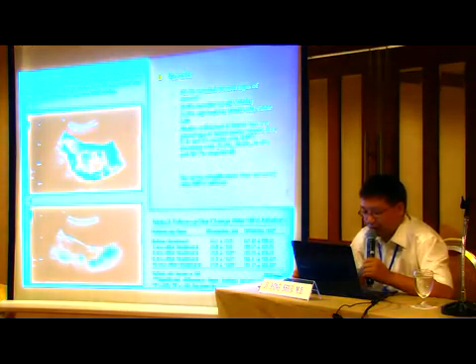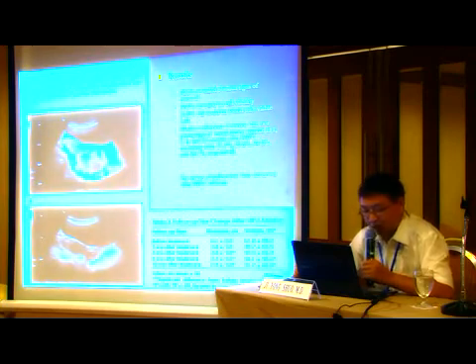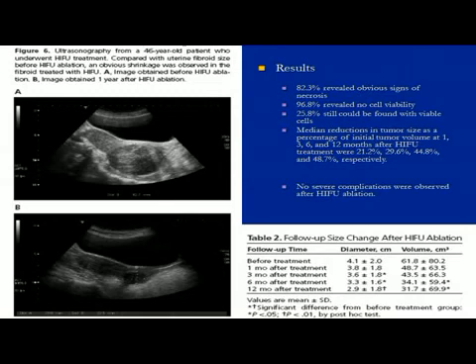However, the tumor generally doesn't disappear, but it may not be probed by the B-mode ultrasound, which is related to the resolution of the B-mode sound. We can notice that this is the tumor. This is a tumor before HIFU, and this is a tumor after HIFU. It was smaller, obviously.